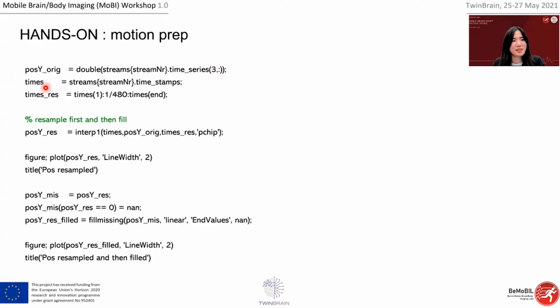So, Sein, can I interrupt? Is this something that people following along might need to change? Sorry, no, don't change it. I just want to say that this is the Z stream that you saw before. Okay, I see. I'm sorry about this. You don't have to change this now.